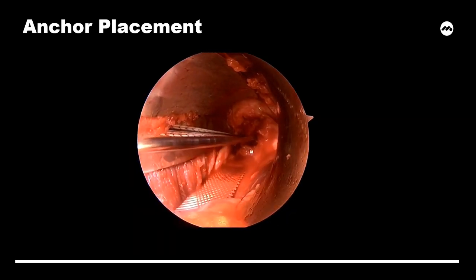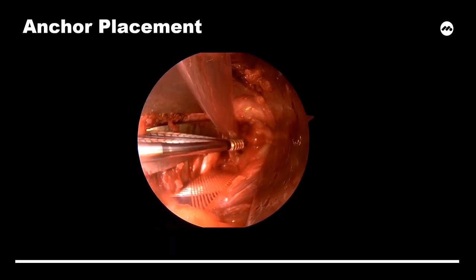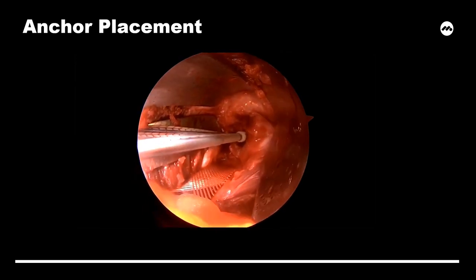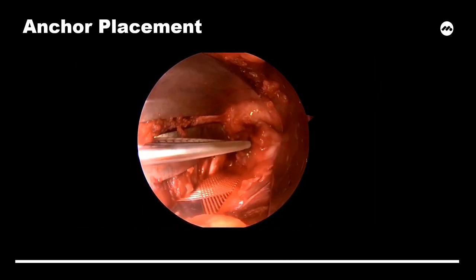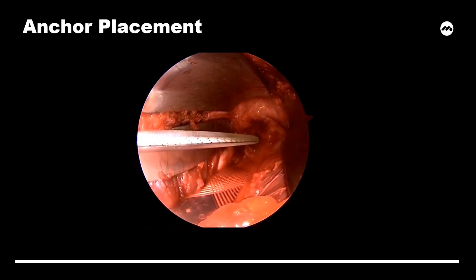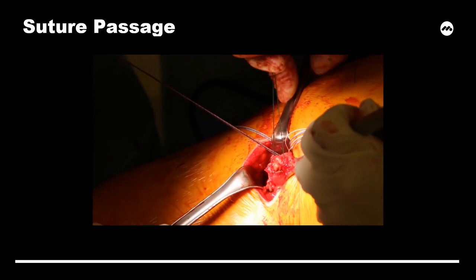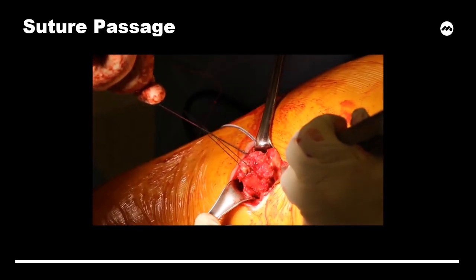This process is then repeated for a posteromedial anchor. We perform a 2-anchor repair with triple loaded anchors, but some biomechanical studies support more anchors. However, no clinical data has explored different anchor configurations.